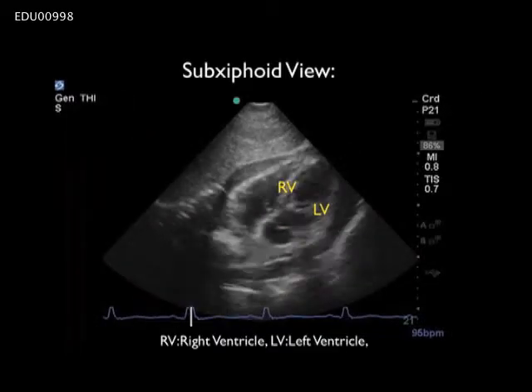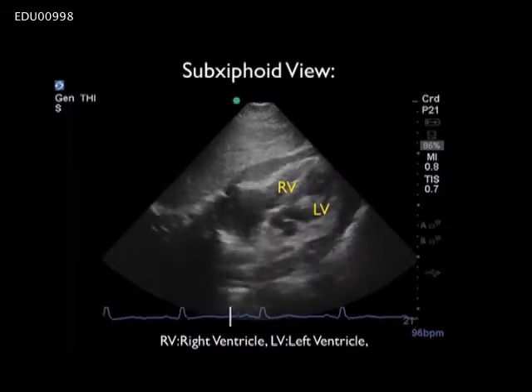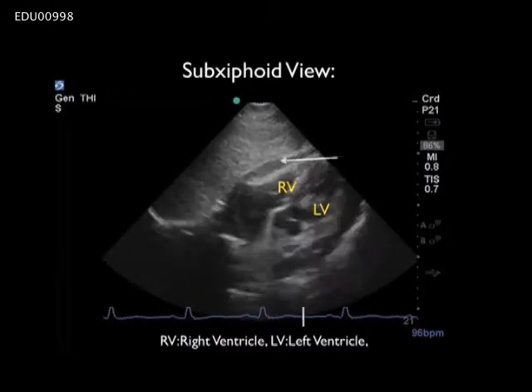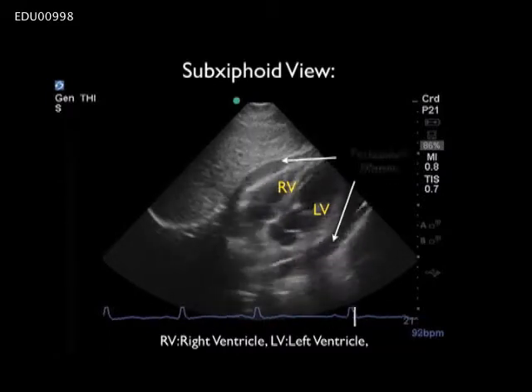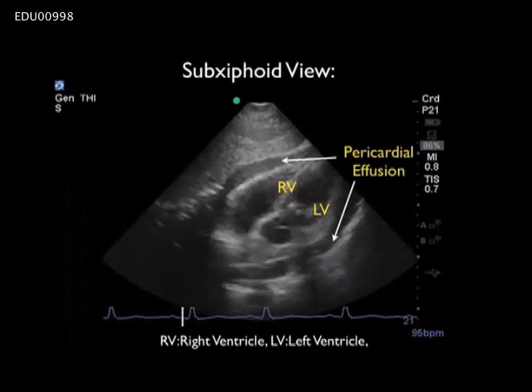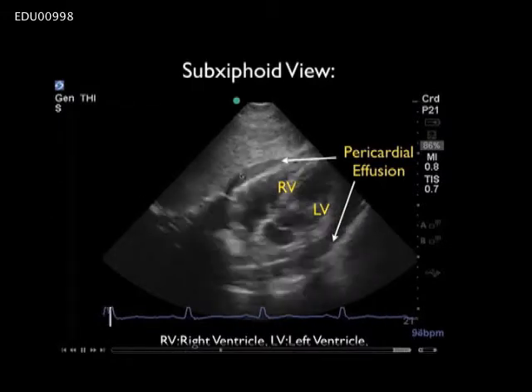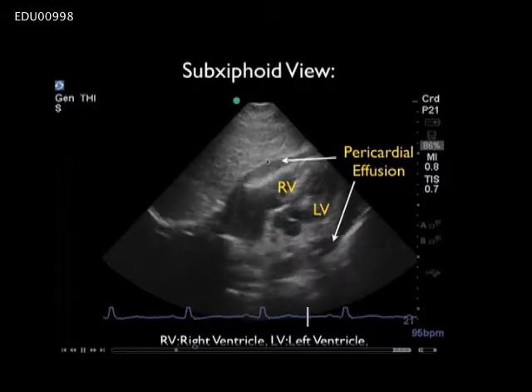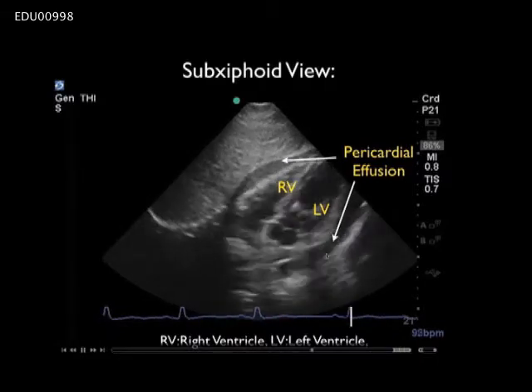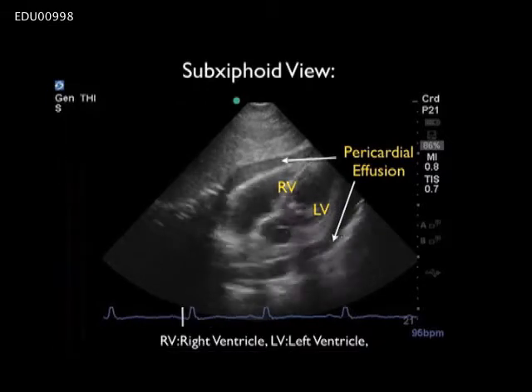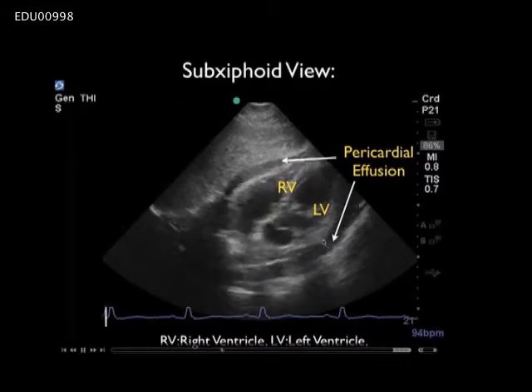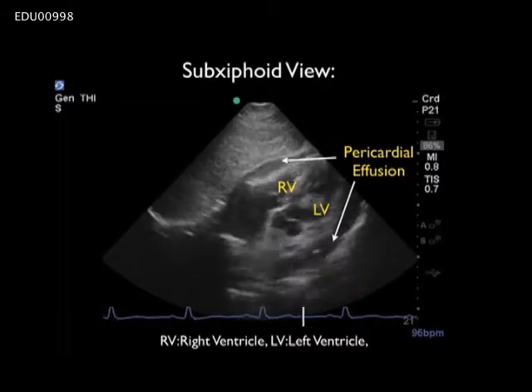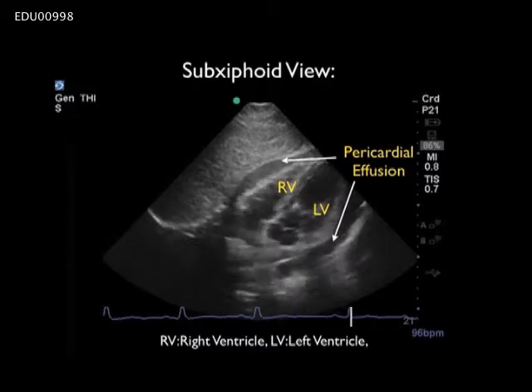Here's another subxiphoid view taken from a hypotensive patient and right away we notice a positive finding. We see the right ventricle anterior and the left ventricle posterior, and there is an anechoic or dark fluid collection layering out around the heart circumferentially — a pretty large circumferential pericardial effusion surrounding both the near-field and posterior aspect of the heart just above the posterior pericardial reflection.